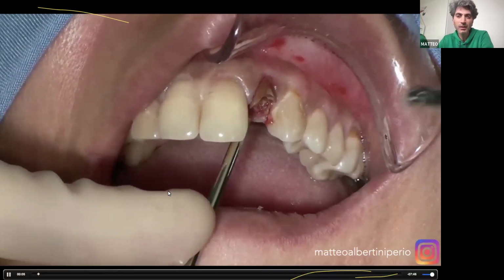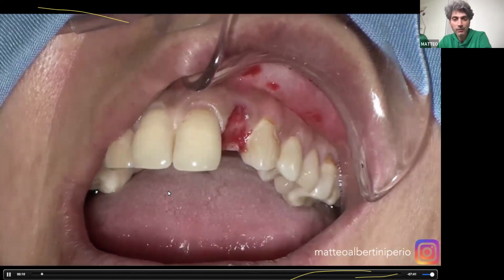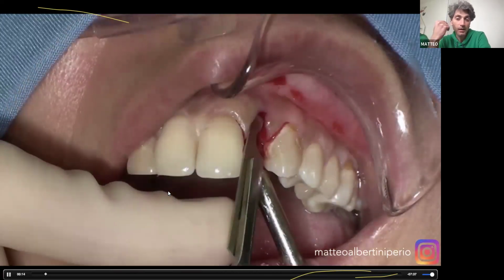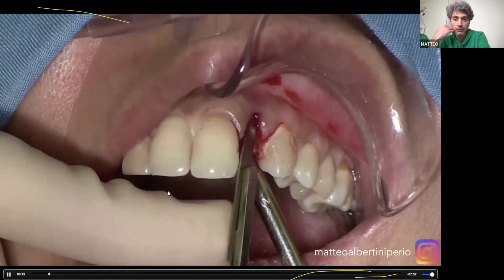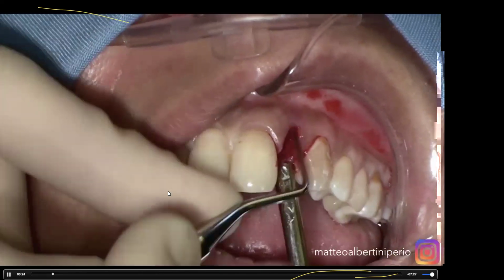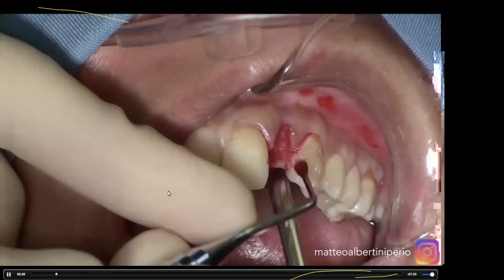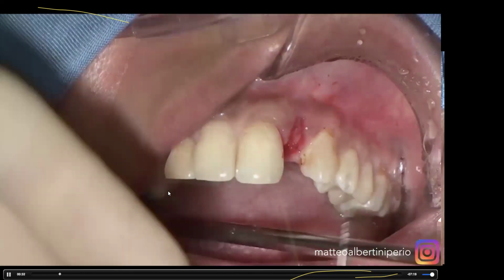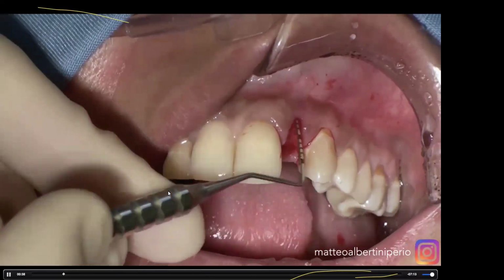We have gingival recession, so total absence of buccal bone, and it could be a very risky case if you don't manage the tissue regeneration. Да, в этом случае, конечно, кейс не сильно простой. Почему? Потому что у нас есть достаточно выраженная рецессия десны в области зуба, выраженный дефицит кости щечной. То есть, если мы не поработаем с дефицитами этих тканей, то, конечно, поставить имплантат здесь будет непросто.